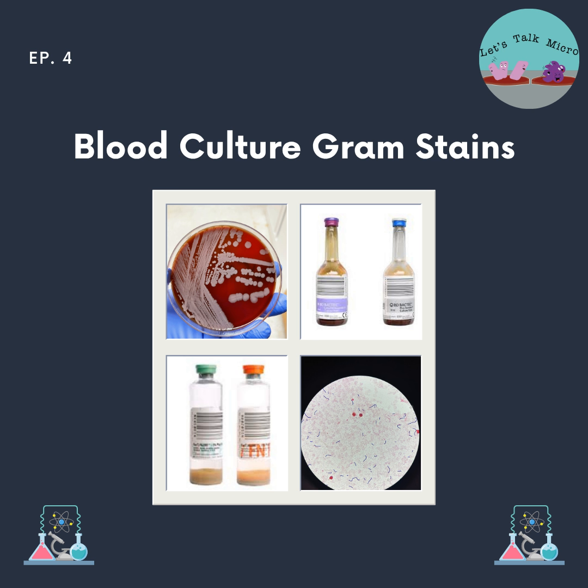Keep in mind that blood culture slides are thicker. And that's why I mentioned before that some places might have a stronger decolorizer, just to help you decolorize it better, because you have a thicker smear. But as far as the staining process, it's the same. You use the same reagents for the gram stain. You keep them on for the same time, just maybe a different decolorizer, depending on the facility.